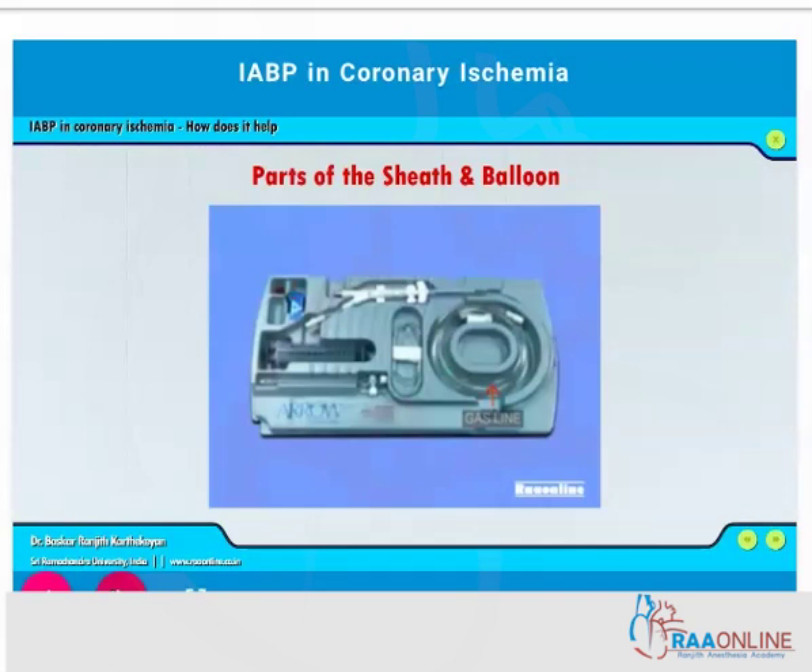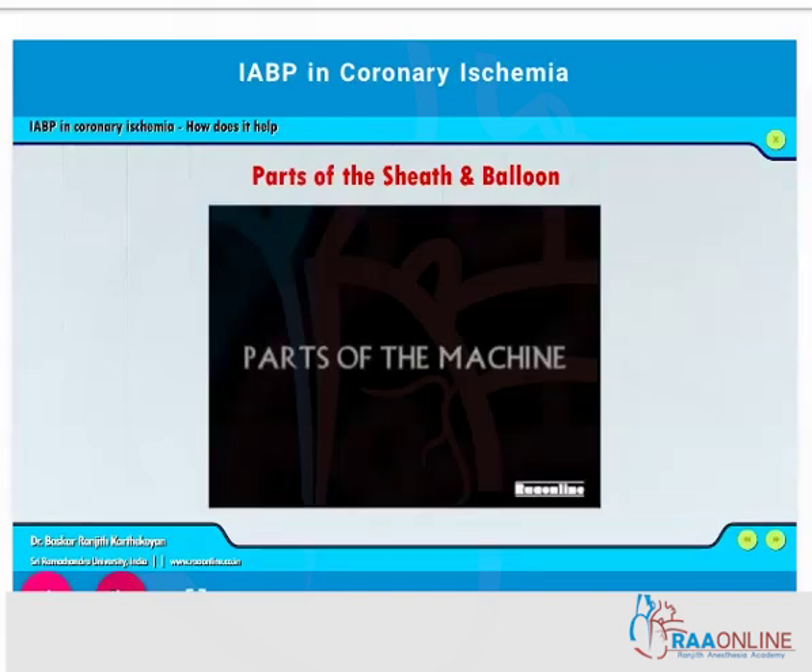The balloon insertion kit consists of the IABP catheter, a one-way valve, a gas line through which helium is usually pumped into the IABP, a pressure line to monitor the pressure, a three-way stopcock, the balloon, and a 50 ml syringe to inflate and deflate the balloon prior to insertion or removal.